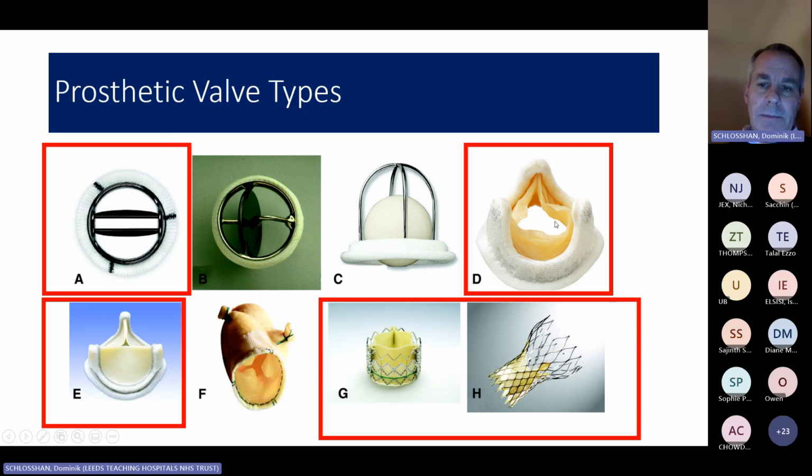And then we have these bioprosthetic valves here. Somebody will get a prize if they know what the difference in tissue is between this one and this one here, but somebody can put that in the chat. Doesn't anybody know what tissue D is and what tissue E is?